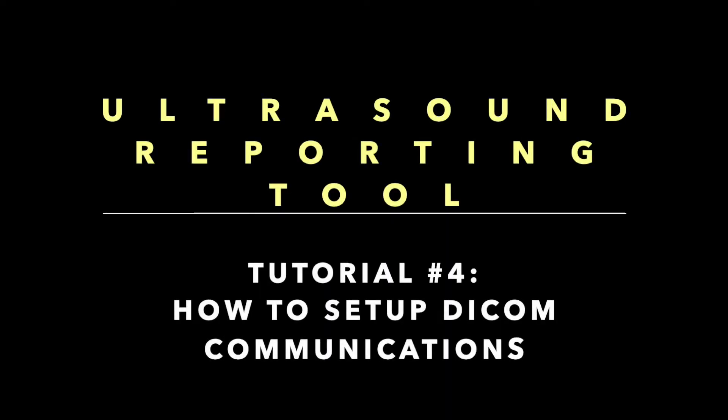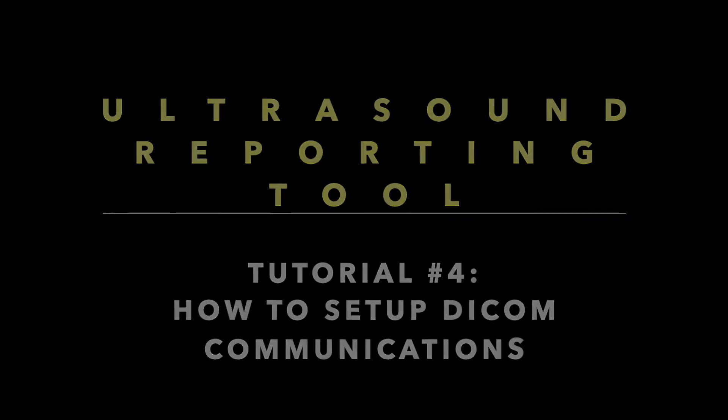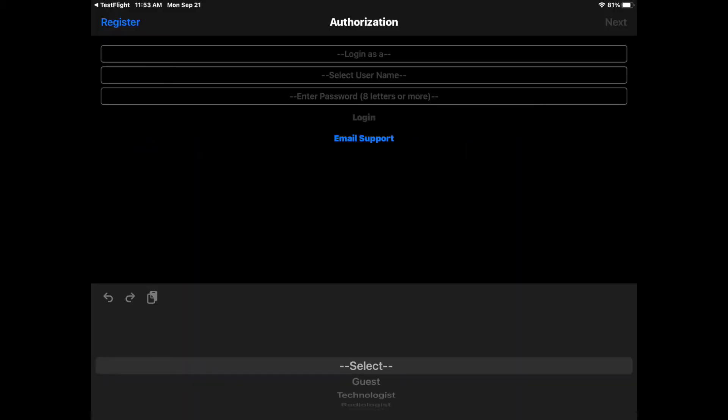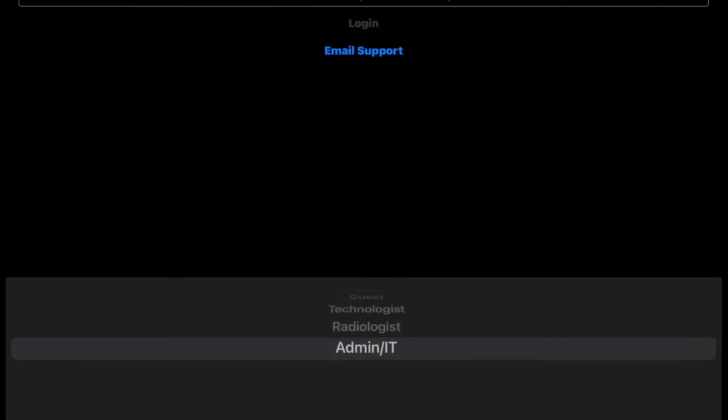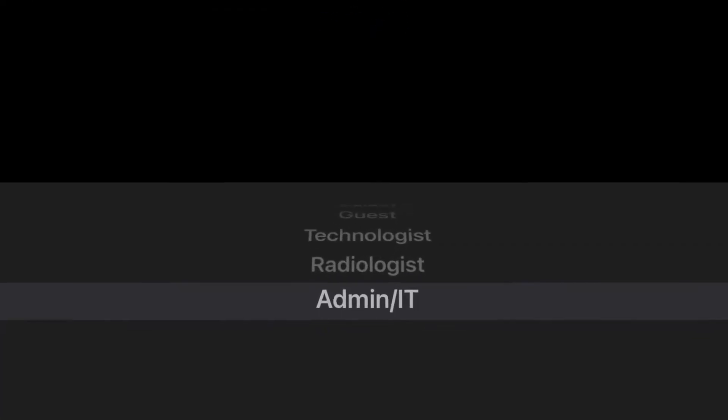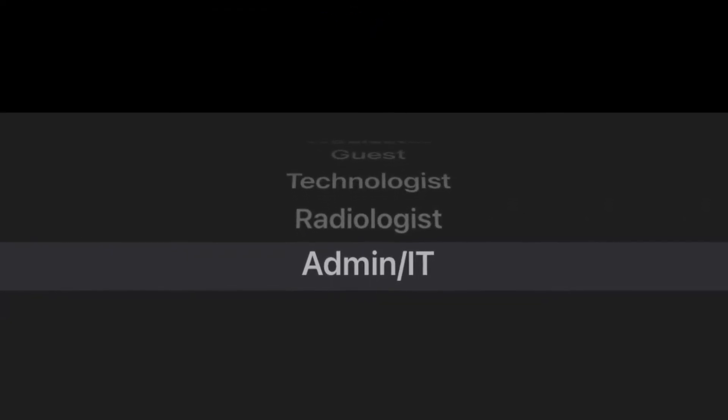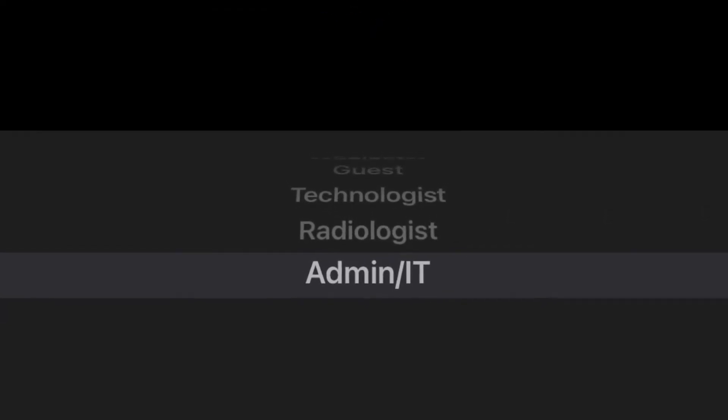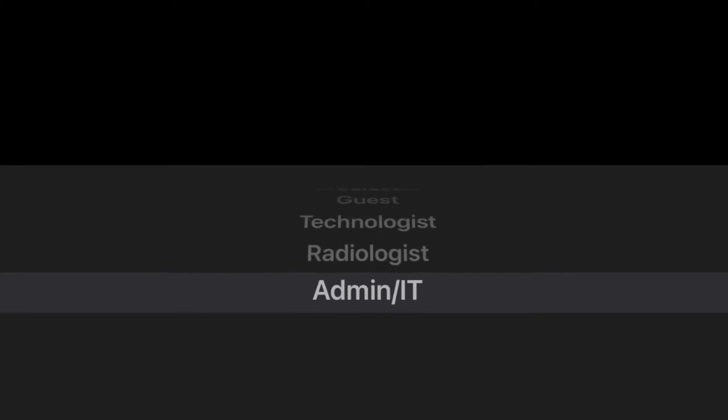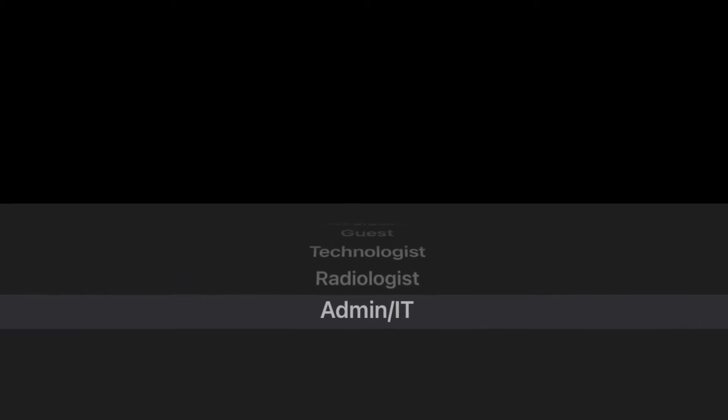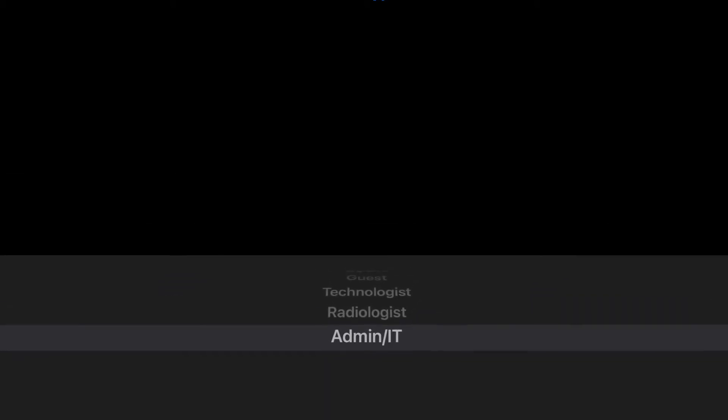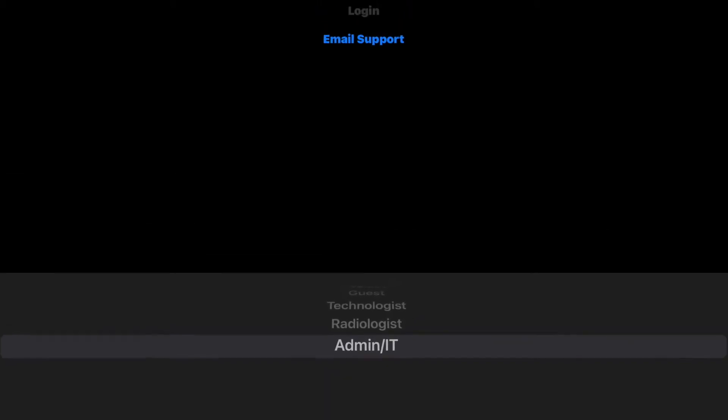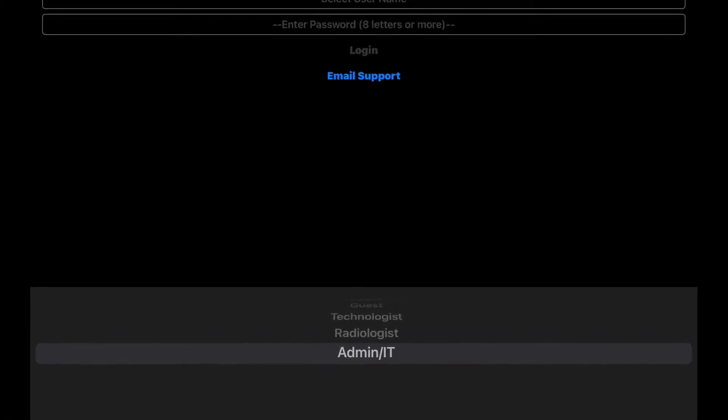Welcome to Ultrasound Reporting Tool Tutorial Number 4: How to Set Up Dicom Communications. After launching the app, you will need to log in as Admin IT. If you have not added an admin password to your app, check the tutorial on How to Create an Admin Password.